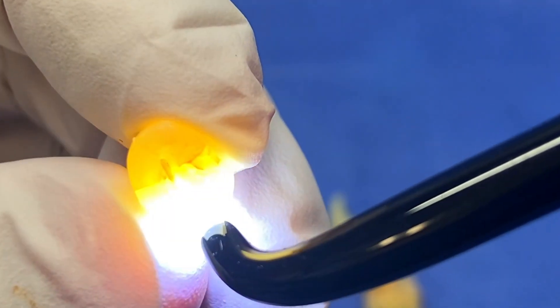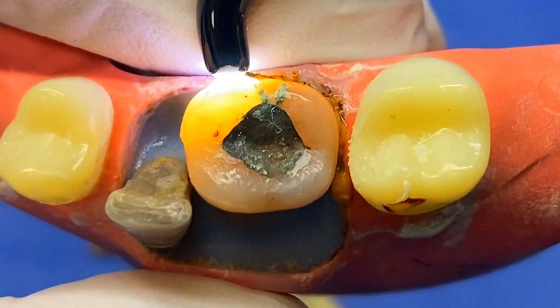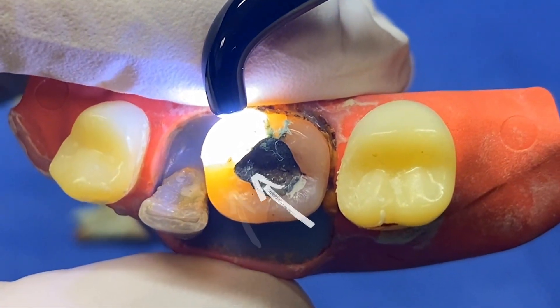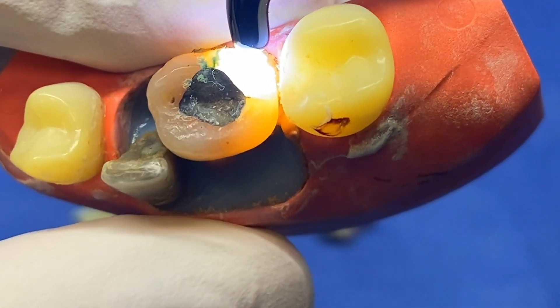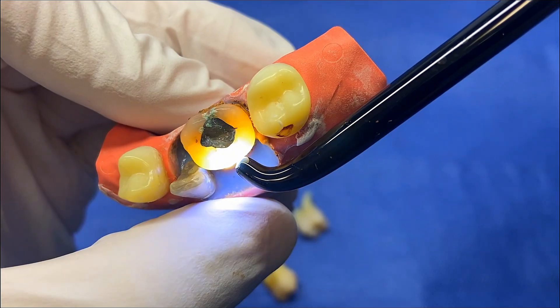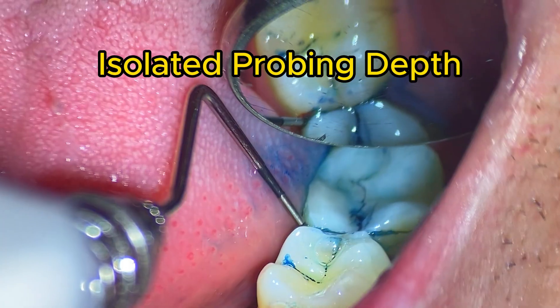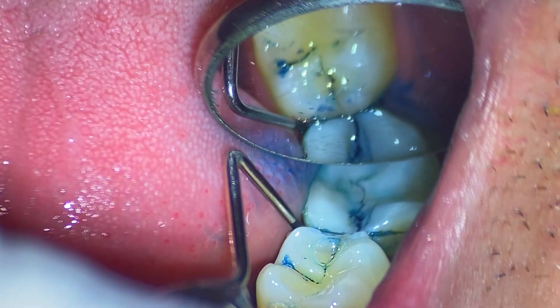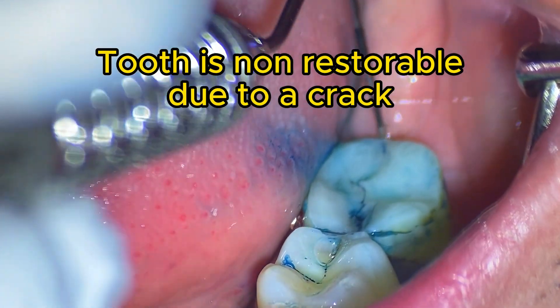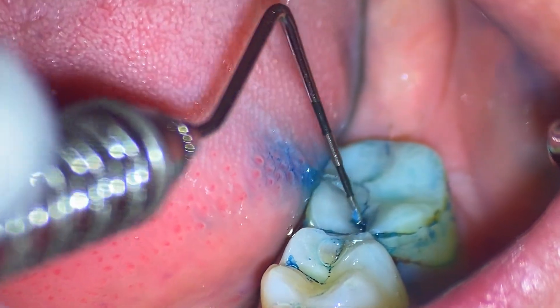So you can really see where the fracture lines are — very helpful. Another classic example: can we check to see if there's a crack? You can see the light is attenuated on that surface, not so much on this side. A little bit of a fracture, craze lines, but definitely more of a fracture here. So that helps us have the conversation with the patient and make a treatment plan in terms of whether or not the tooth is viable, and if the patient's complaining of biting sensitivity, it helps us better determine a prognosis.